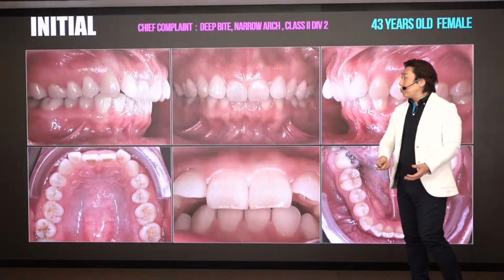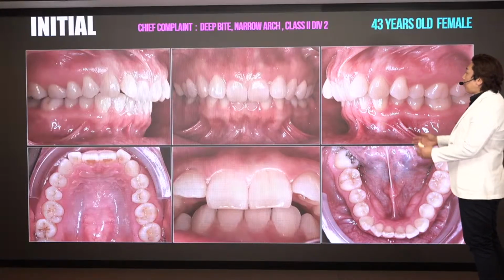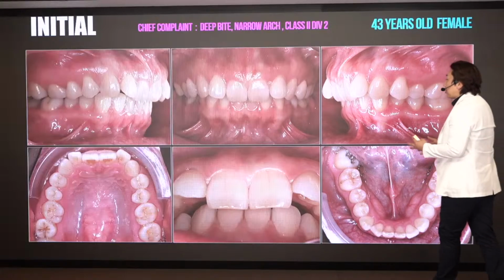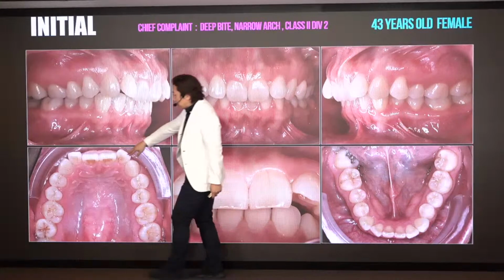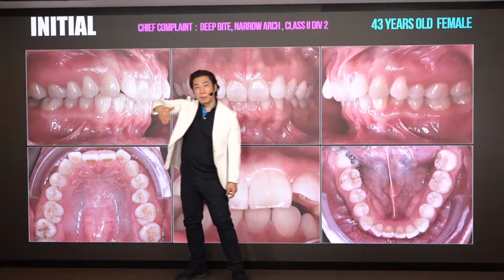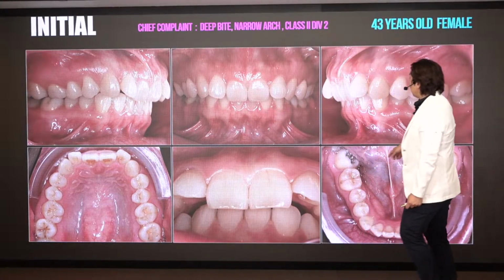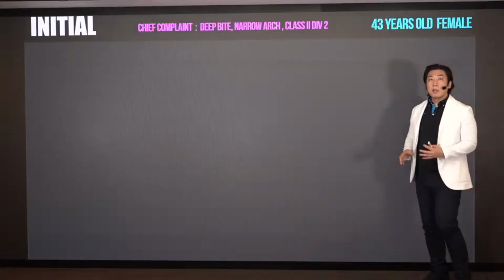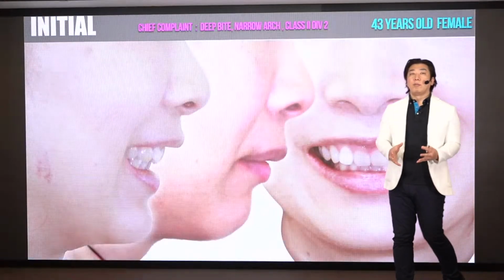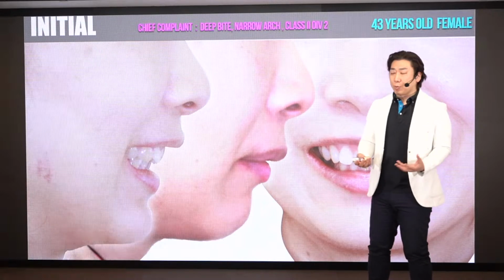Okay? Go to the patient photos. This is the patient initially. Chief complaint: deep bite, narrow arch, class 2, division 2. As you can see here, the upper incisor is definitely lingually inclined. Then it locks the mandible. Then if you decide on the normal approach, upper molar distalization may not be good.